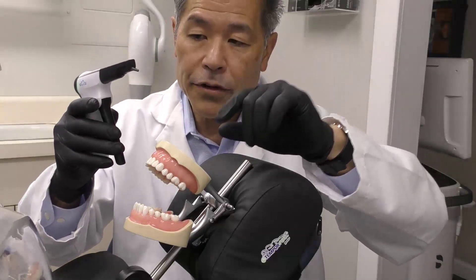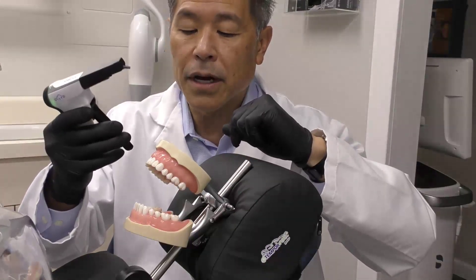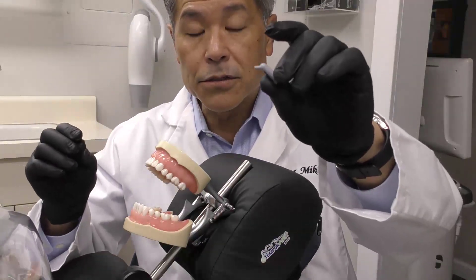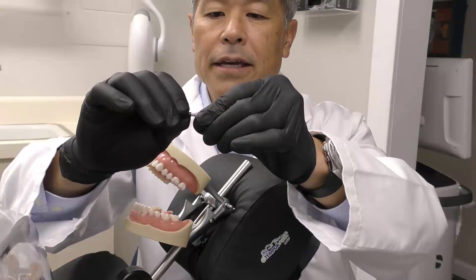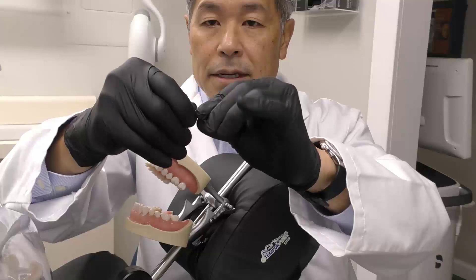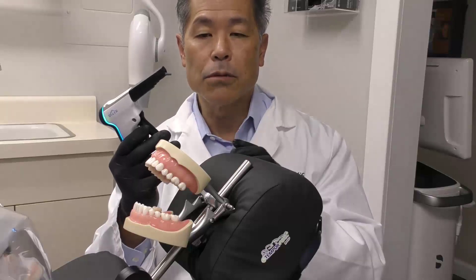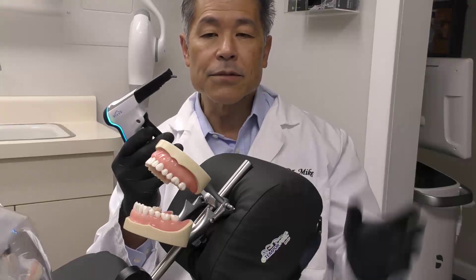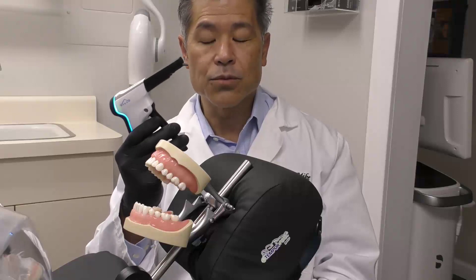If you have these little micro preps or a very constricted preparation, the heated sculptable composite can be expressed from the compules. The step-down tip extends the compules nozzle by about 12 millimeters — you just take the compules and screw the step-down tip on; it just threads into the compules tip. Once warmed up, this composite is going to flow like a flowable composite, adapting to the walls of your preparation. But as it cools, it's going to have the properties of your sculptable composite, because that's really what it is.